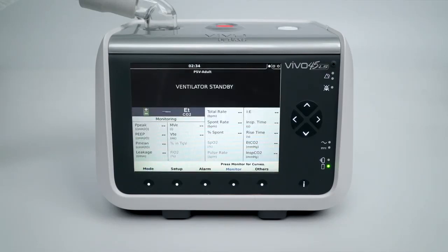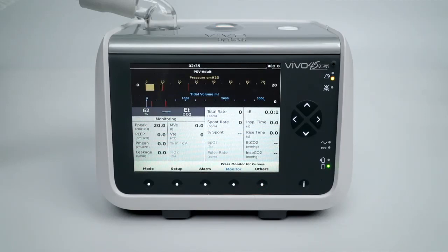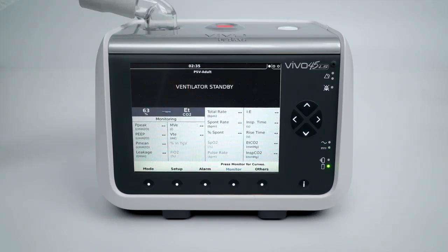To start ventilation, press and hold the Start-Stop button on the Vivo 45LS for approximately 4 seconds to begin the treatment. Release the Start-Stop button when the progress bar is filled. You can also press the Start button shortly, then press the button underneath the Start option.